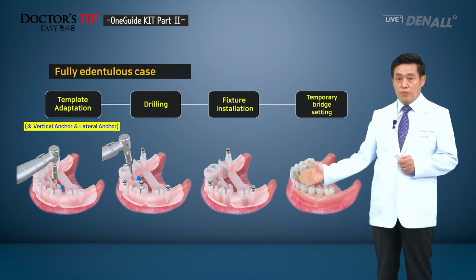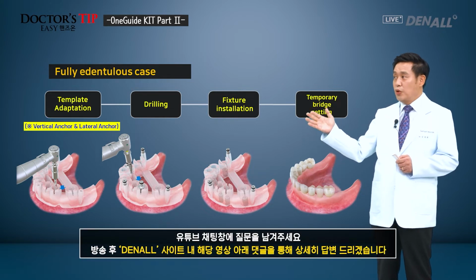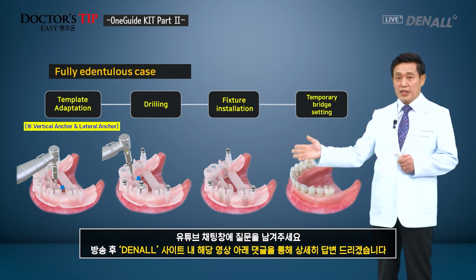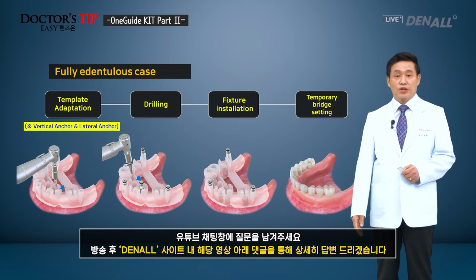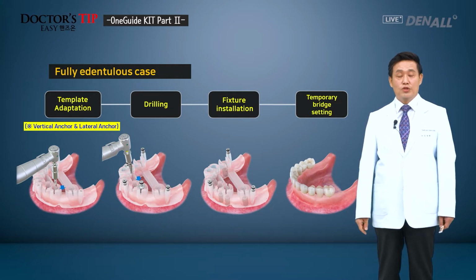After that, prefabricated prosthesis is going to be used, a temporary bridge type, and it's going to be connected to the abutment. We're going to check the relations with opposing tooth as well as the occlusion, and I'll show you this through hands-on. Hands-on will begin shortly.